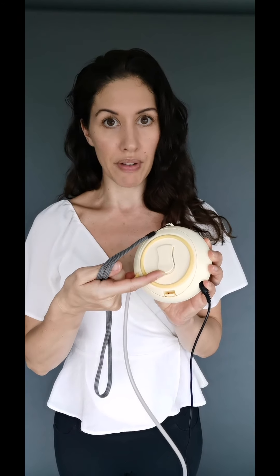So this is the main unit. It's quite nice — it comes with a little clip at the back.